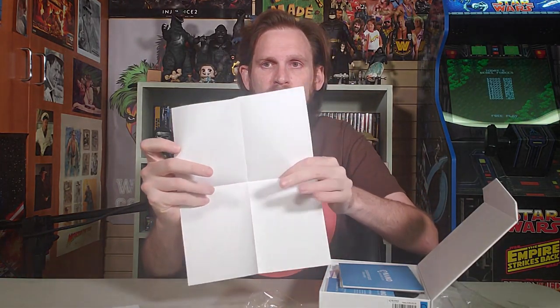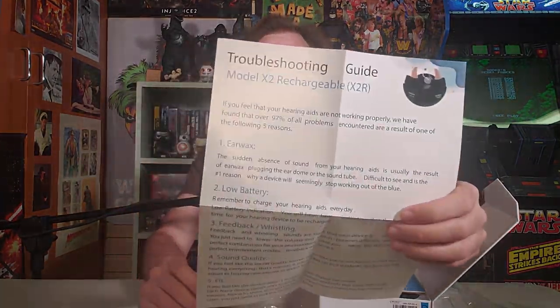They give you a number for any questions, which is good. And then we've got a guide — so yes, the Model X2 Rechargeable. Earwax! They cover that right away. That's immediately what I'm thinking — like, what do you do, you just go and blow it out?